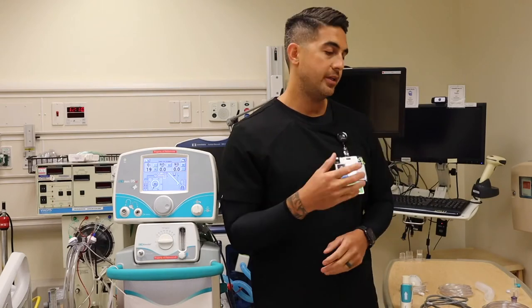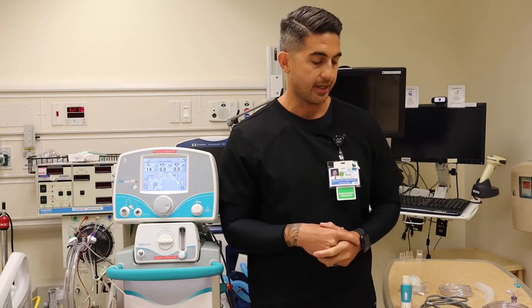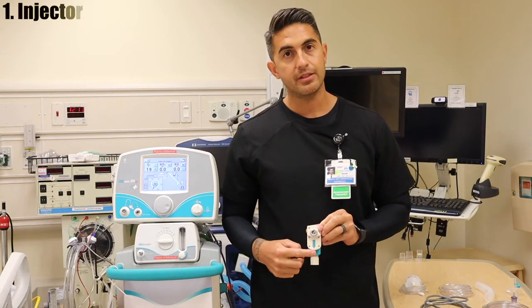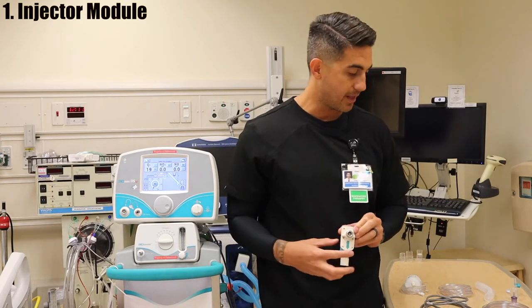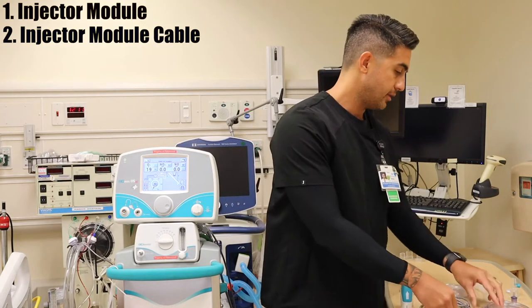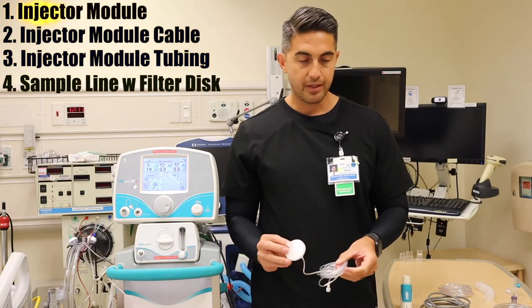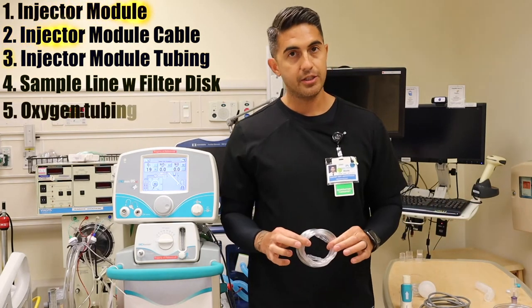Now I'm going to show you the needed components to create your assembly circuit for your pre-use check. Most importantly is your injector module. Note the green arrow line — this indicates which way the flow should be going. You have your injector module cable, your injector module tubing or line, your sample line with filter disk, and a separate oxygen tubing.